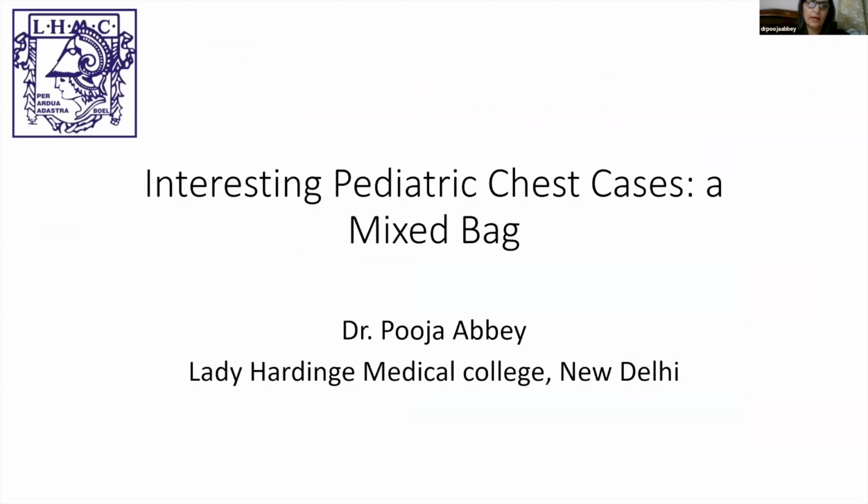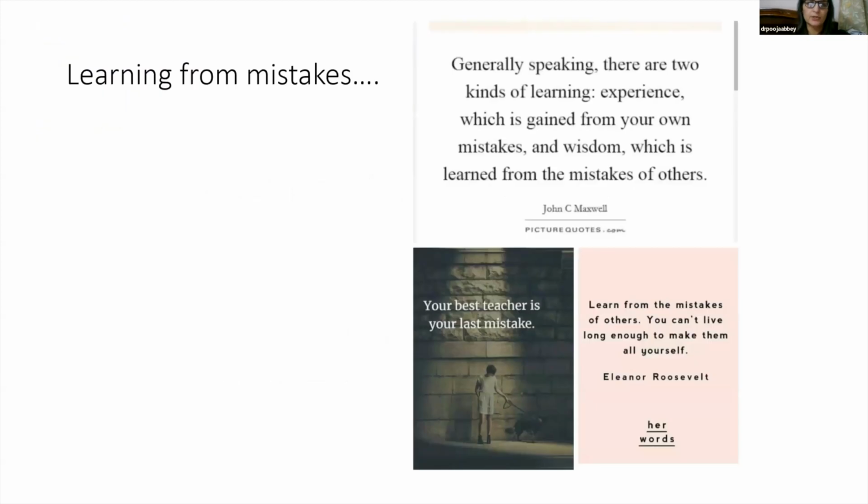This is going to be like a case-based session. So I'll be showing a few interesting cases which we've done in the past few years at our institution, and these are all pediatric chest cases. And this is also going to be a session where I'm talking about the importance of learning from mistakes.